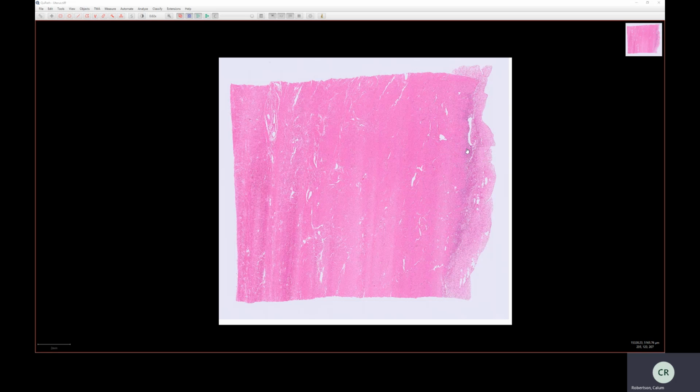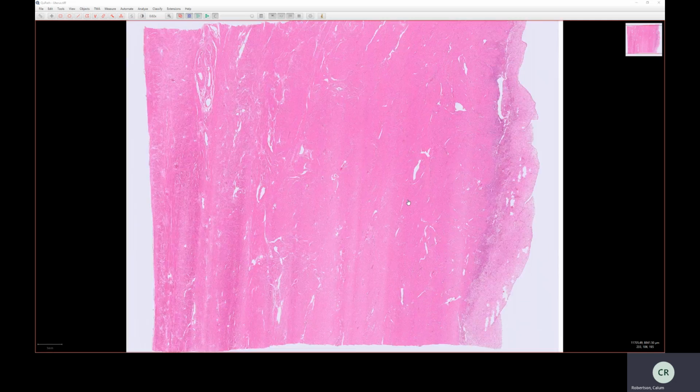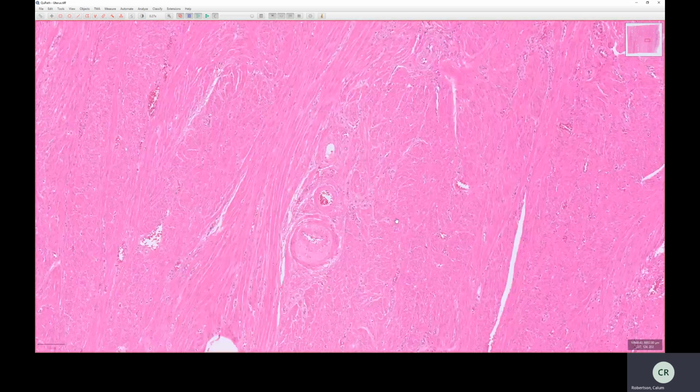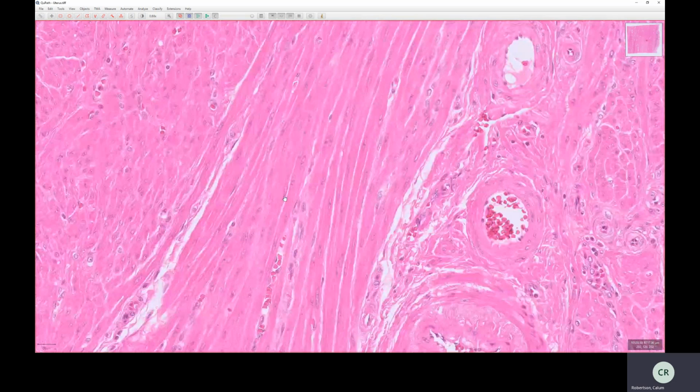Below that, so that's the endometrium. Below that, forming the vast majority of the wall thickness here, is this very pink, very thick layer, which may look familiar to you at this stage because we've looked at this substance a few times now, and it's because it's smooth muscle.